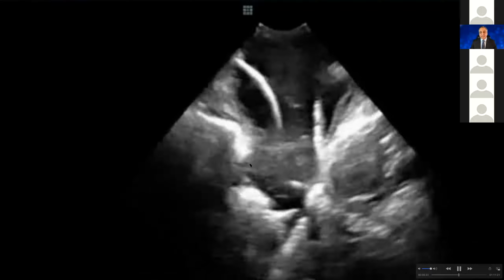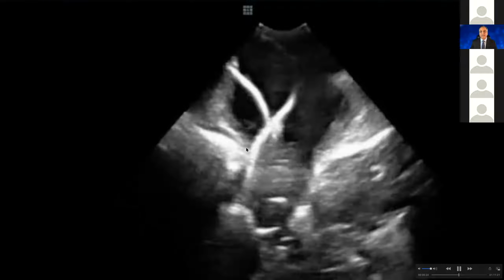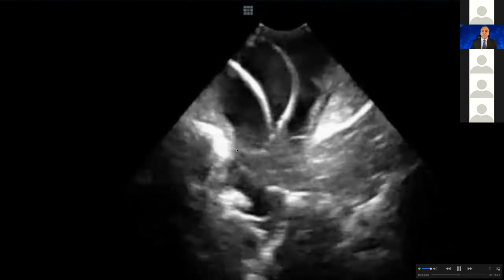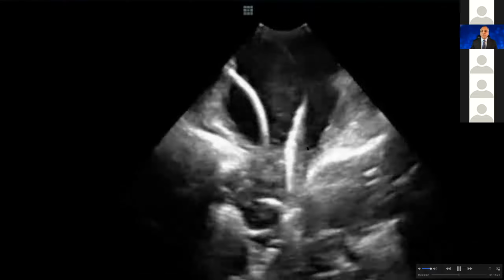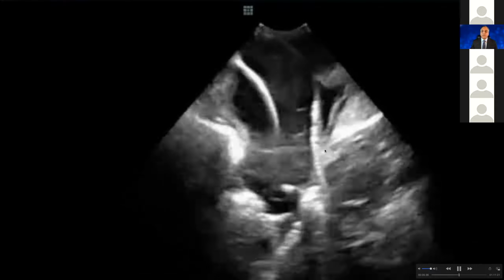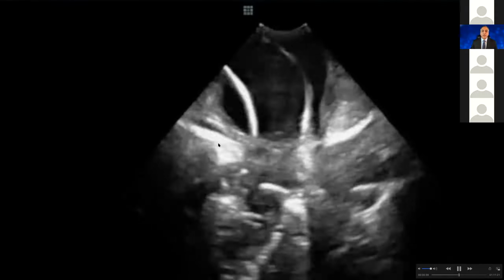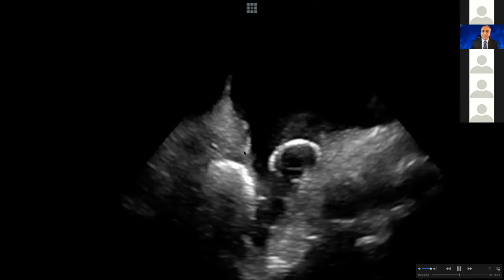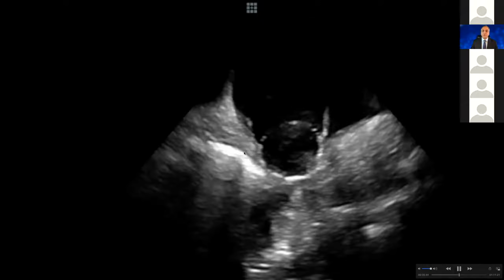Anterior, because I see the orifice of the vein. Exactly right there. I just brought the ablation catheter to the inferior part of the right inferior pulmonary vein, release the curve, going to the superior part of the right inferior pulmonary vein. Superior part, inferior part. Now, let's look at it. We put the mapping catheter inside the right inferior pulmonary vein.